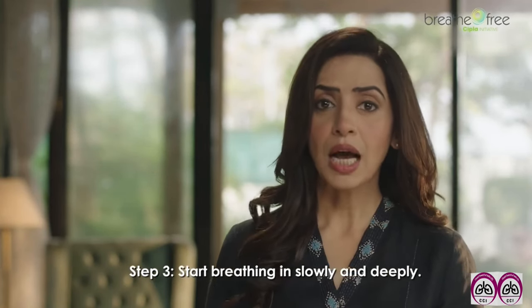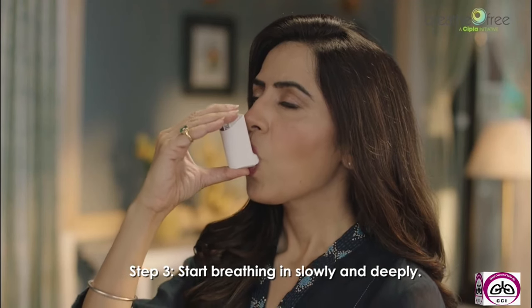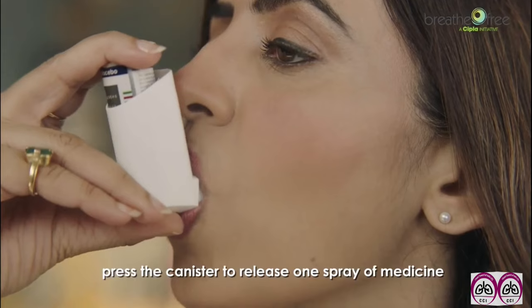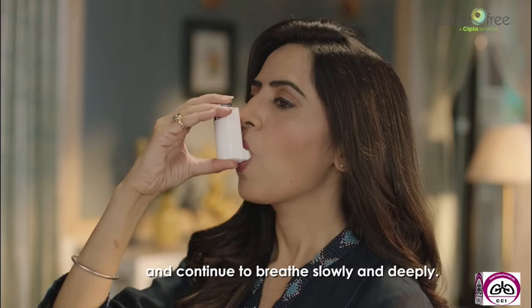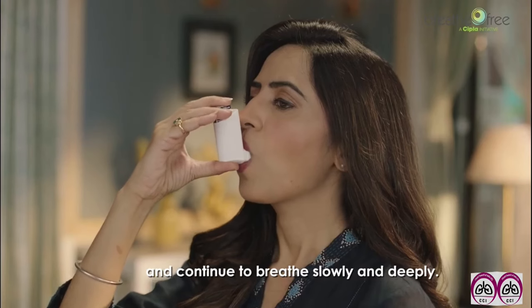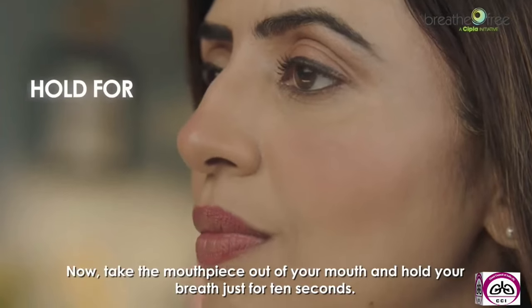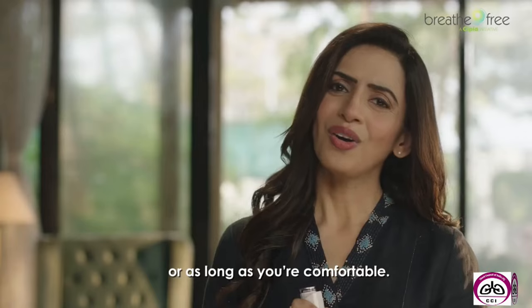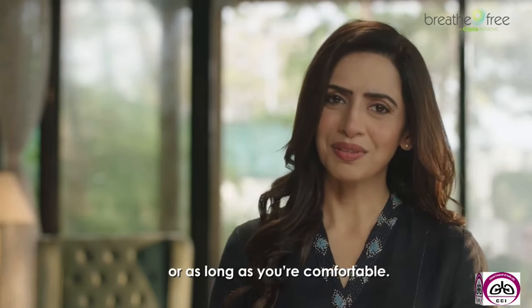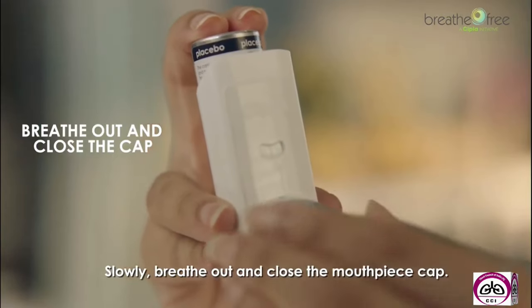Step 3, start breathing slowly and deeply. While you're doing that, press the canister to release one spray of a medicine and continue to breathe slowly and deeply. Then take the mouthpiece out of your mouth and hold your breath just for 10 seconds or as long as you are comfortable. Then breathe out, close the mouthpiece cap.